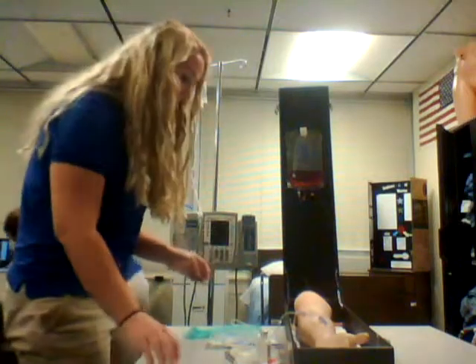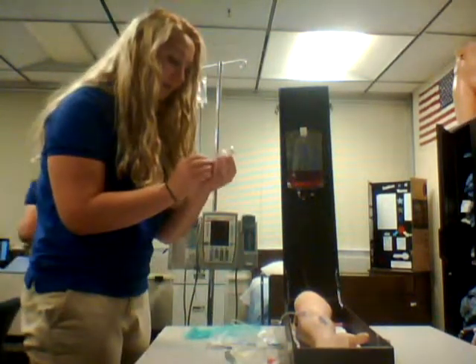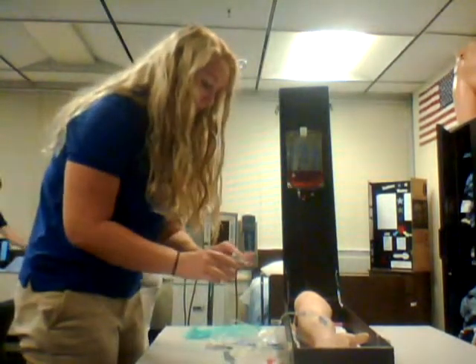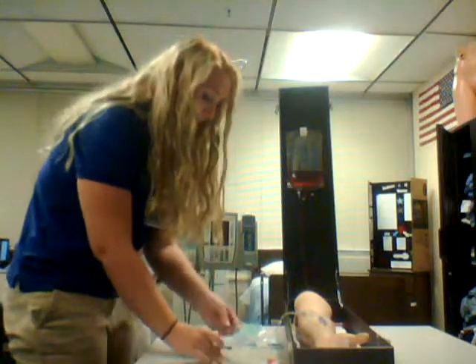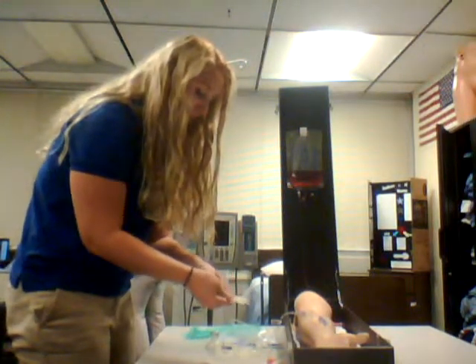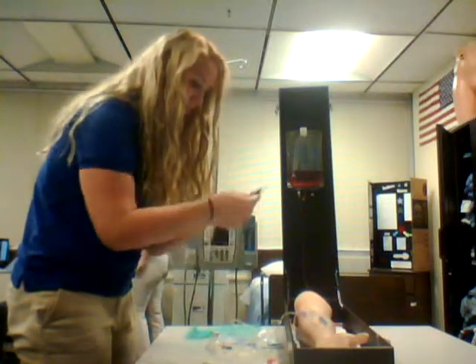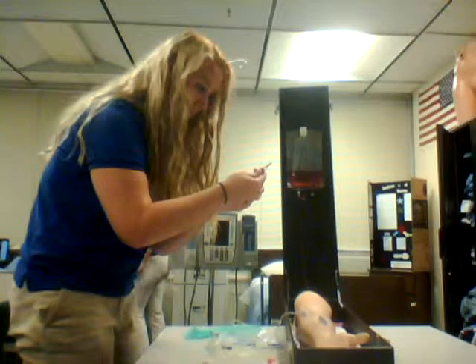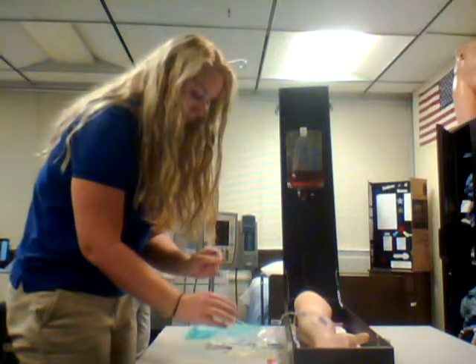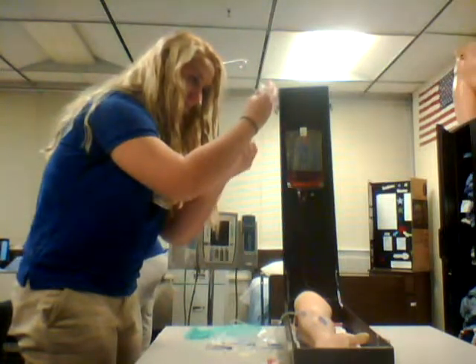So I'm going to take my Flagyl, and I'm going to look and see that it's not expired. I see that it's not expired, and I'm going to draw up half a milliliter of Flagyl to put in my piggyback bag. And then on the previous video, I didn't do this, but I'm going to put my initials, date, and time on the sticker on the tube. This lets us know which day we need to change it.